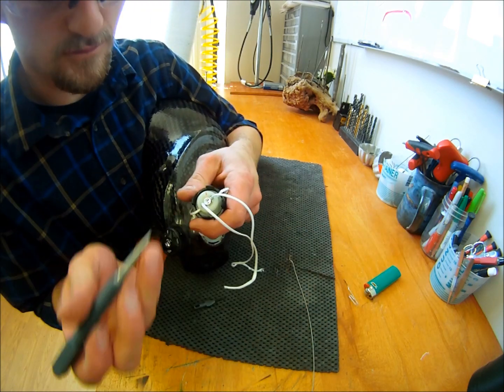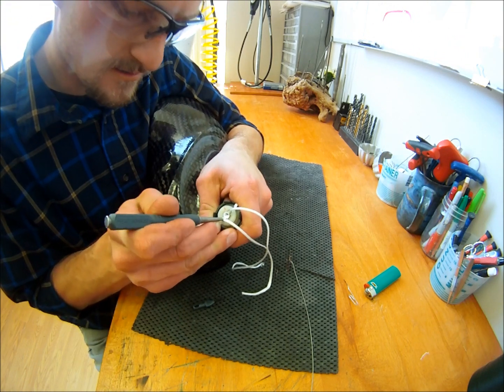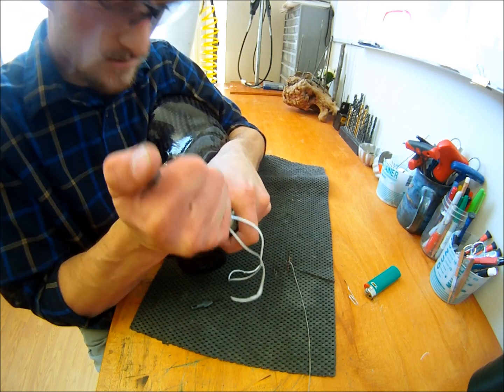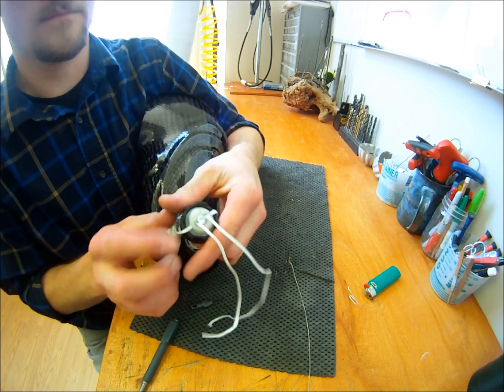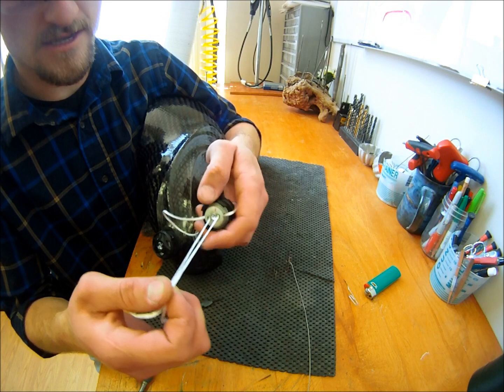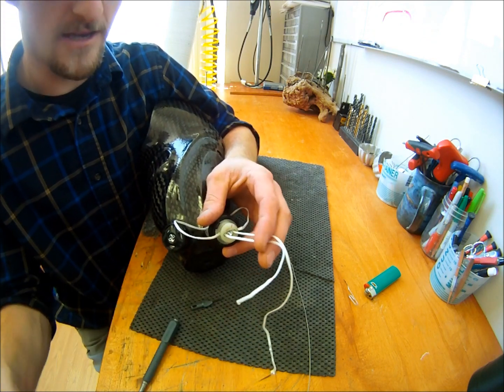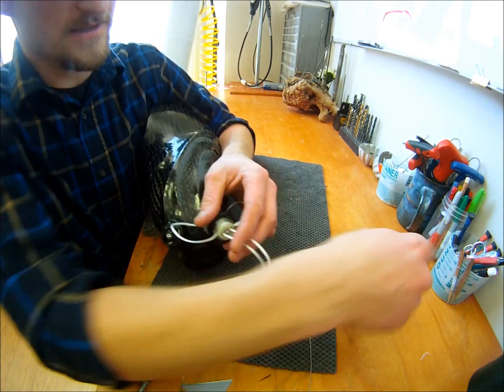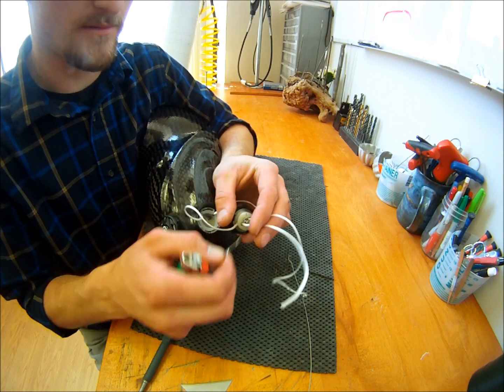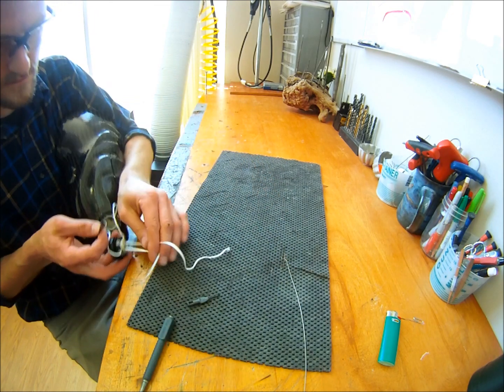At that point you'll have to push them from the top with some kind of tool, a nail set I'm using here, so that they drop all the way in to that recess. You'll have the slack hanging out the ends. There's several ways to cut it. If you don't have a razor blade, or something similar or sharp, you can heat up a paper clip and pull it tight and cut it that way. I'm going to use the razor blade here.